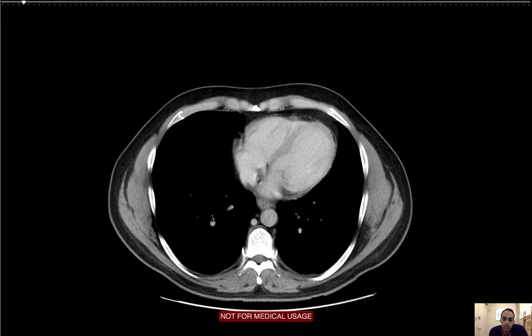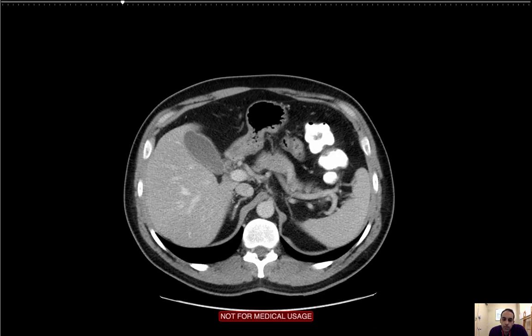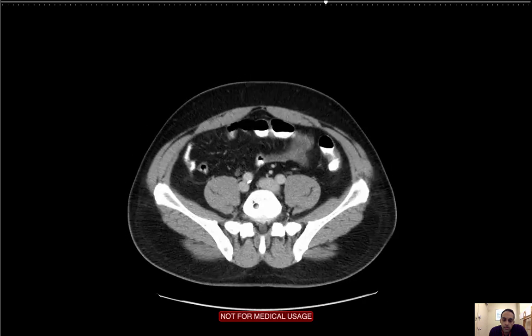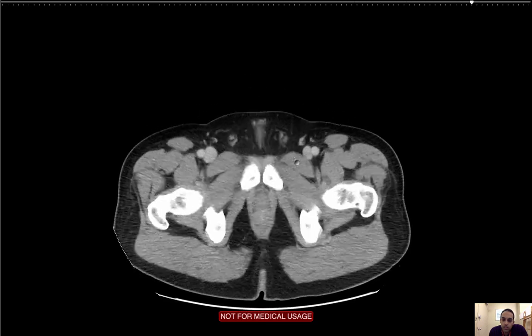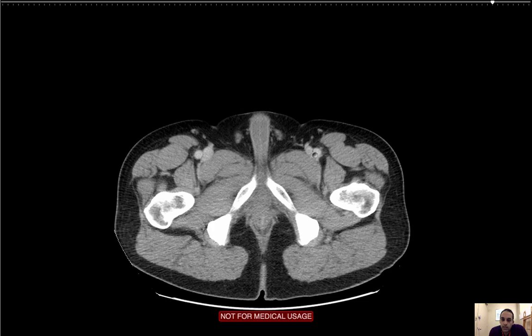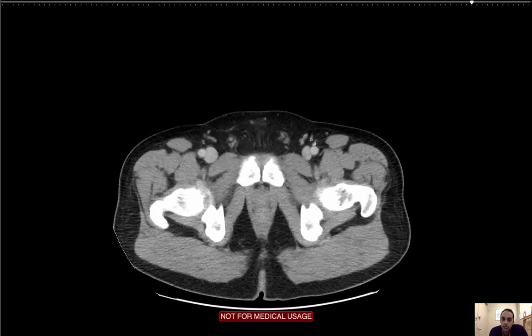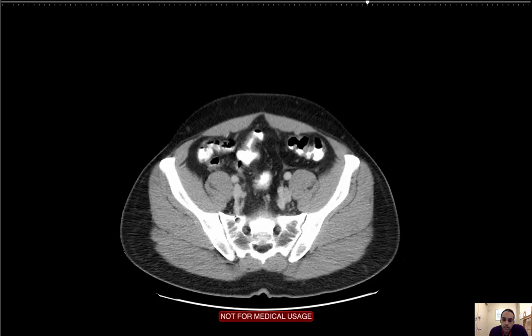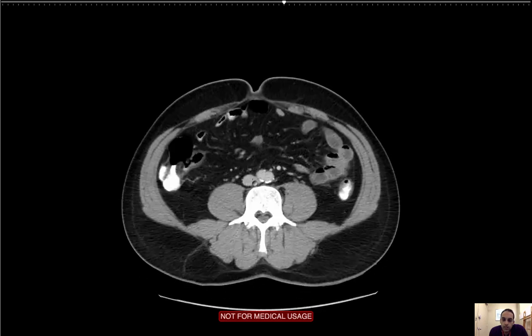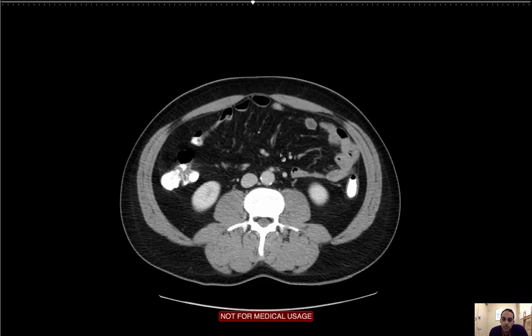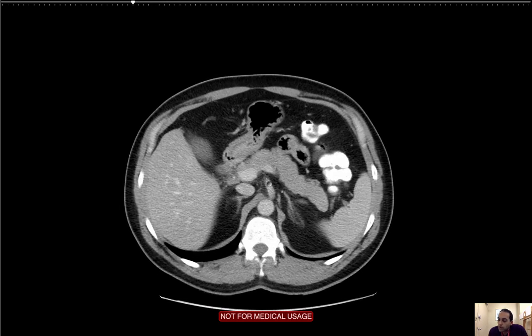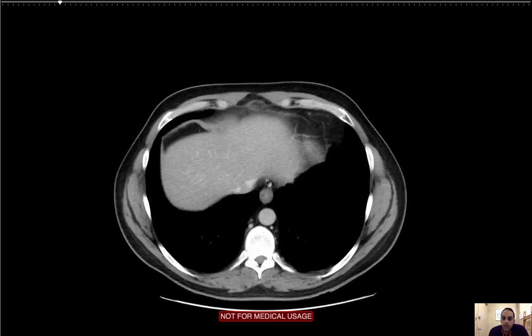Flipping back over to the axials, I'm going to look for nodes — just running the retroperitoneum, looking for any enlarged nodes greater than one centimeter in short axis. I'm seeing a couple of inguinal nodes, which are normal. Running each external iliac and the internal iliacs, then taking another look in the mesentery. I'm not seeing any adenopathy.